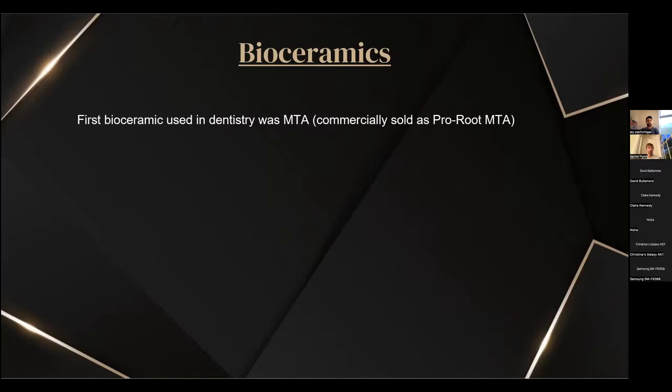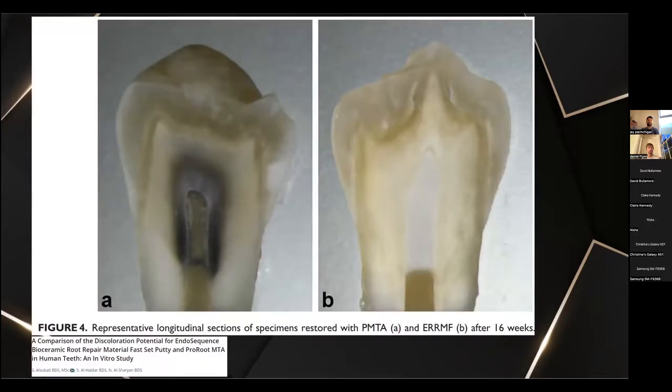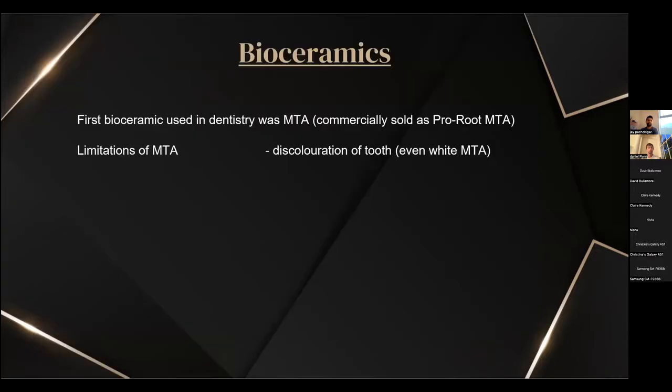The first bioceramic was MTA, sold as ProRoot MTA. It was a fantastic material at its time, very capable, but it did have some limitations. Initially, it did discolor the tooth. Even when they changed the formulation to white MTA, that also did discolor the tooth. This is a comparison between MTA over here, where you get quite significant discoloration after, I think, 4 months, compared to one of the newer materials over here. So ideally, we try and avoid using it a lot in the anterior region if possible.